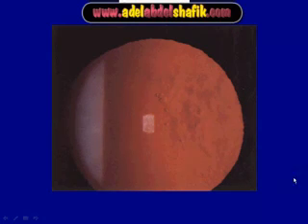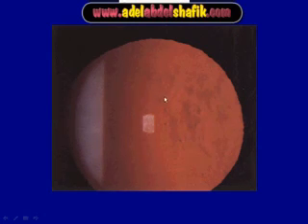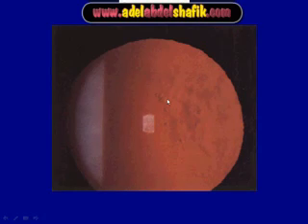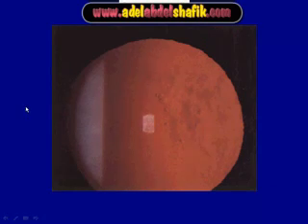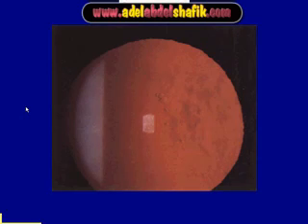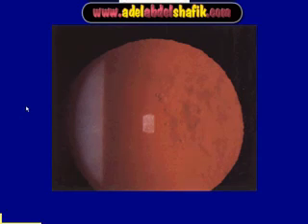Again, a retro illumination showing a rarified iris. You can see the iris here is less pigmented or not pigmented at all, so you can see the red reflex through it. You can also see these water droplets in the crystalline lens indicating early cataract. So retro illumination means that you illuminate something behind to see something in front.